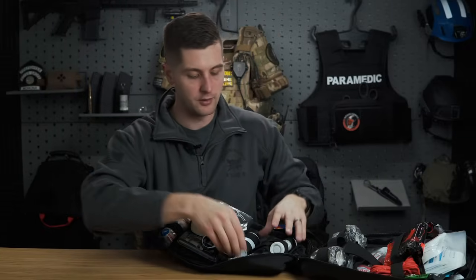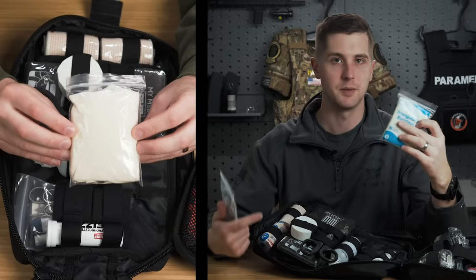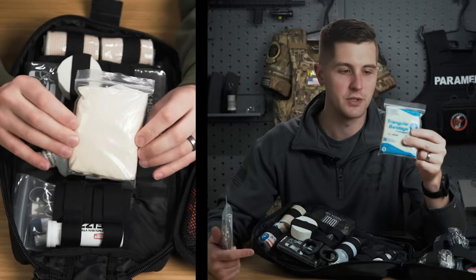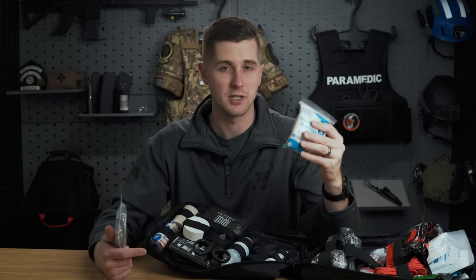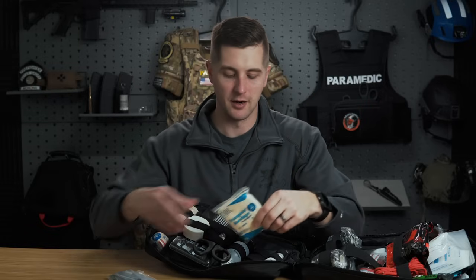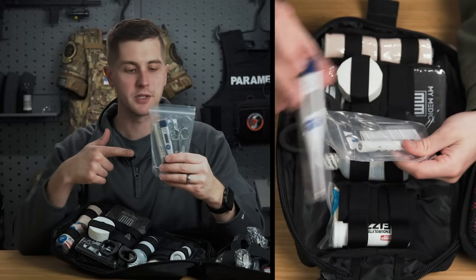Now, the last thing in kind of this lid, not counting these two flaps here, we've got a triangular bandage for a sling for the splint, can be used as a bandana, can be used as a pressure dressing. These are one of those things that I'd say always keep on you. It's great to have these pre-packaged ones because they're so small. You can make these yourself out of sheets and cut them into triangles. That's what we used to do on ski patrol, but I really like the pre-packaged ones because they're right there, really easy to do.